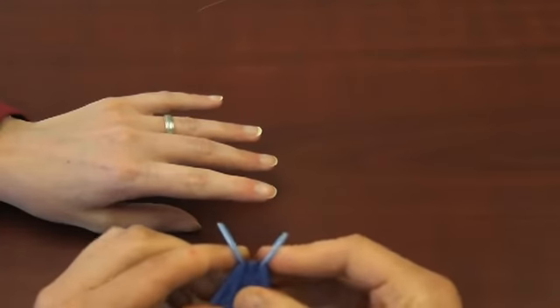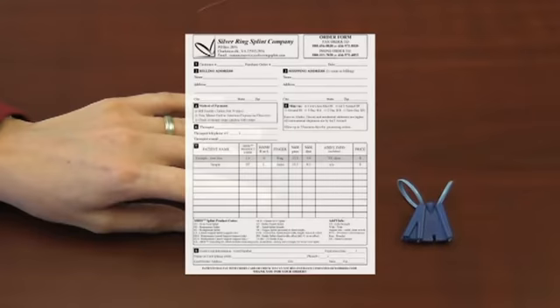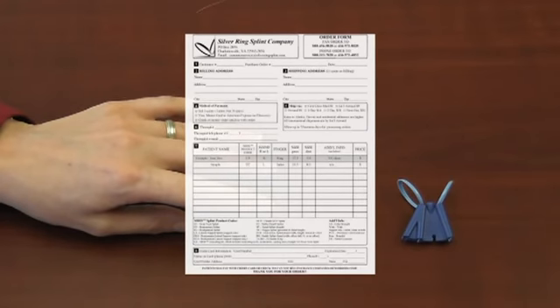Once you find a size combination that fits well, record it on an order form. You do not need to write that the boutonniere splint will be used to correct lateral deviation.